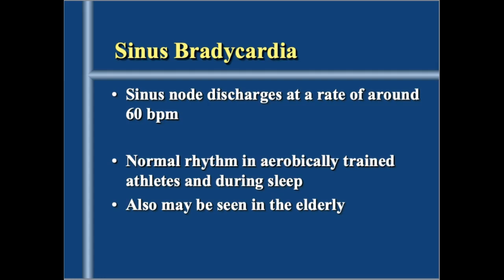So sinus bradycardia, you know how we look at the heart and we say, is it fast, slow, or normal? When we have sinus bradycardia, we'll have a rate of 60 or usually less than 60. I don't agree with this slide. I would say 59 or less for those of you taking tests. Just know that the sinus node will usually discharge between 60 and 100, and anything less than 60 we're going to call sinus bradycardia if it's sinus.